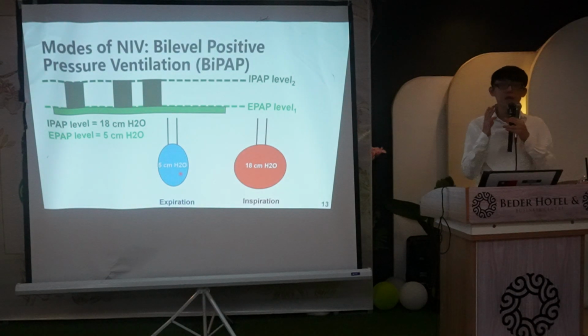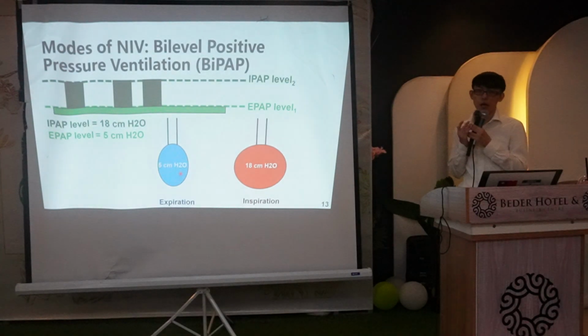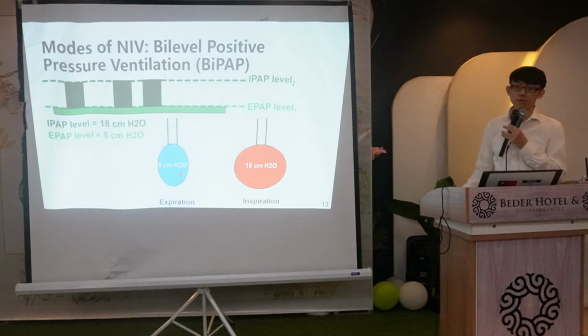And this change has one benefit. One major benefit is that they can deliver ventilation to the patient. Okay? So under BiPAP, they have ventilation, so they can wash out carbon dioxide compared to the CPAP.